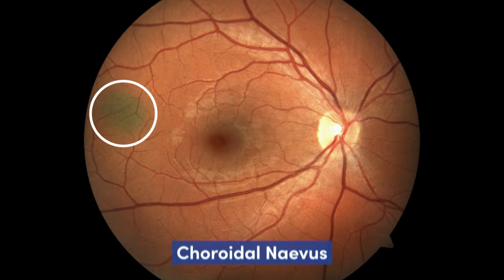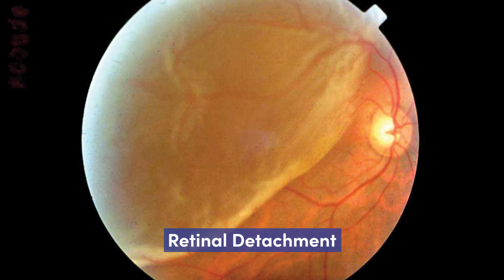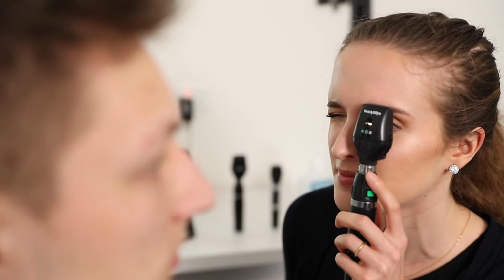Finally, examine the retinal periphery by asking the patient to look up, down, left and right, looking for abnormalities such as a pigmented ocular tumor or a retinal detachment. Now repeat the examination for the left eye, remembering to use your left hand and your left eye.